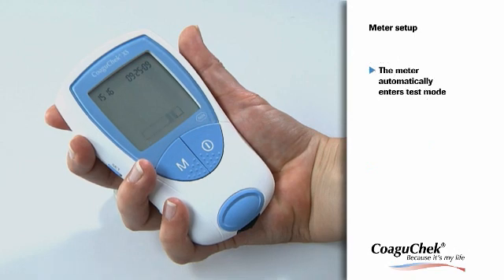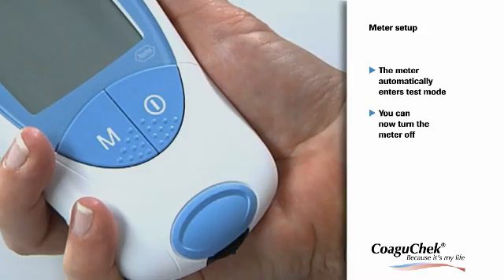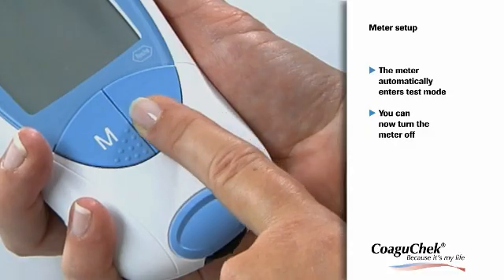As you can see on the display, the setup procedure is now complete, and the meter automatically enters test mode. If you don't want to proceed with testing, you can now turn the meter off.